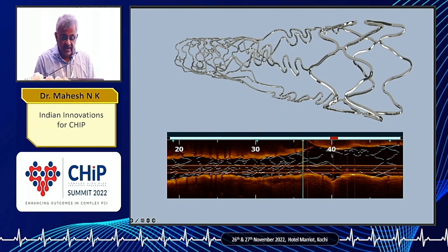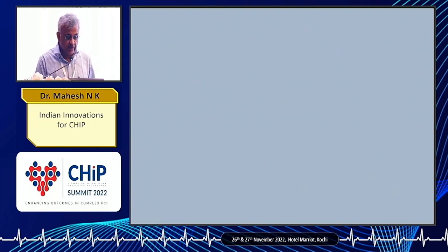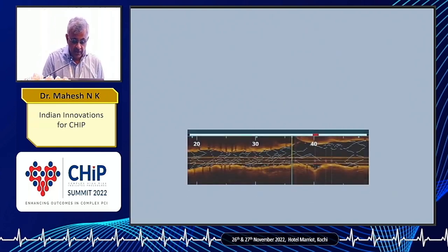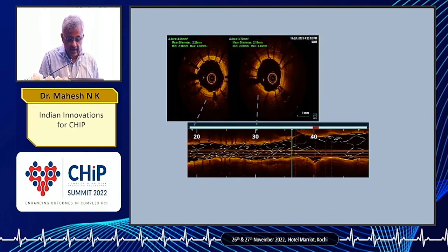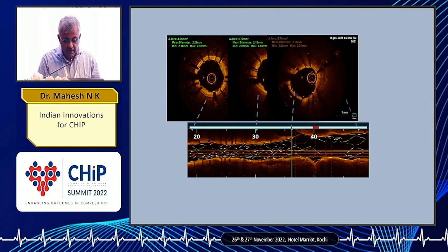So this area is not crowded at all, so that when you put a stent into the main vessel, the total stent load gets decreased significantly there. So this is how it looks eventually. This is the distal part, very well done. Good apposition I've got.